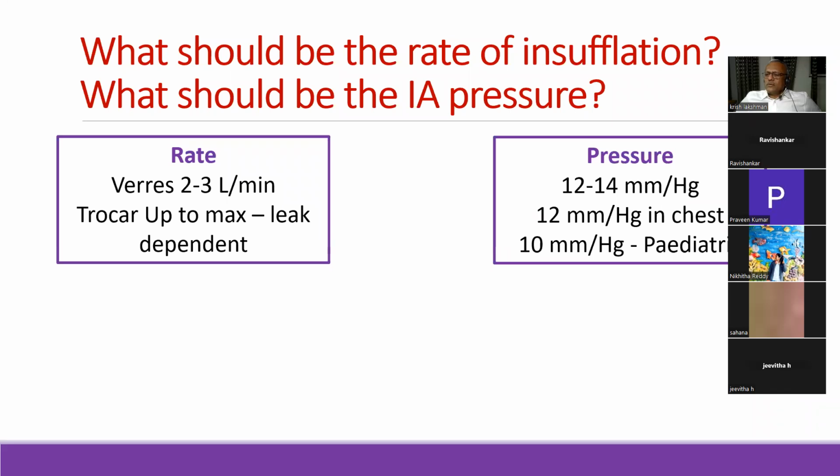All right. So yes, in thoracoscopy, you have a choice of either doing a one lung anesthesia, or if that's preferred, you can collapse that lung and work on that side of the thoracic cavity. The patient's oxygenation and carbon dioxide are maintained with one lung, or you may choose to put pressure and collapse the lung on that side if required. And in that case, you don't usually use a higher 14 or 16, use 12 millimeters.